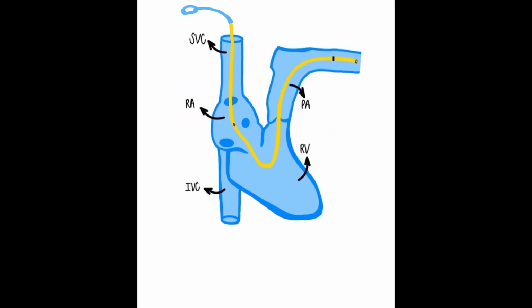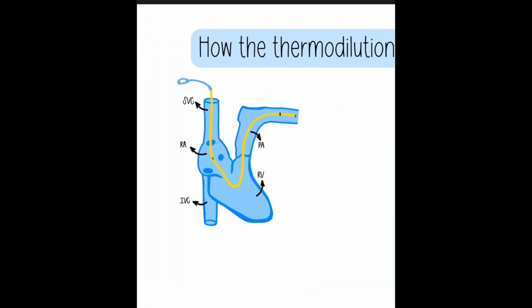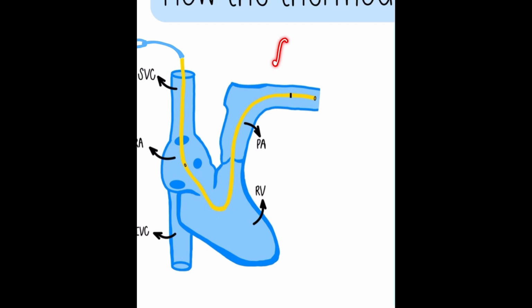So what it is measuring is the time that it takes from when you inject all of that saline, that you had at this cooler temperature outside of the body. And you have the thermistor, the temperature probe, over here. So this cooler fluid is going to travel from here, point A, up to point B. And that thermistor is going to go, hey, that's a little cooler than the normal body temperature we are at. So we go, oh, and then we see how long it takes for that to return back to the normal temperature of the body. And that's how long it took for the rest of the blood to move past this and, quote, wash out that cooler saline.